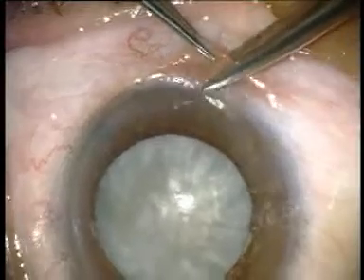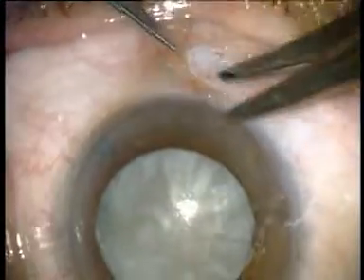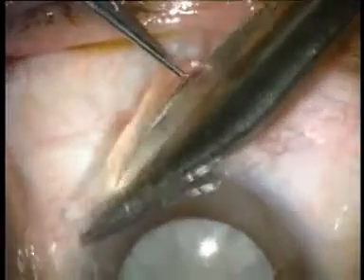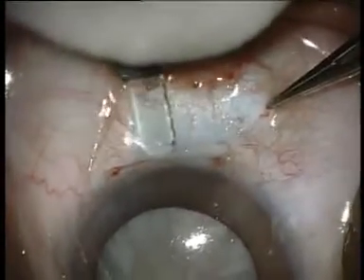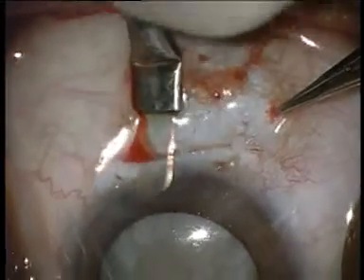For a temporal approach to the patient's left eye, a conjunctival flap is dissected from 1 to 5 o'clock, giving good limbal exposure. Gentle diathermy is applied to bleeding points and vascular areas. A crescent blade makes a partial thickness groove just behind the limbus, which is extended 2 to 3 millimeters into clear cornea.